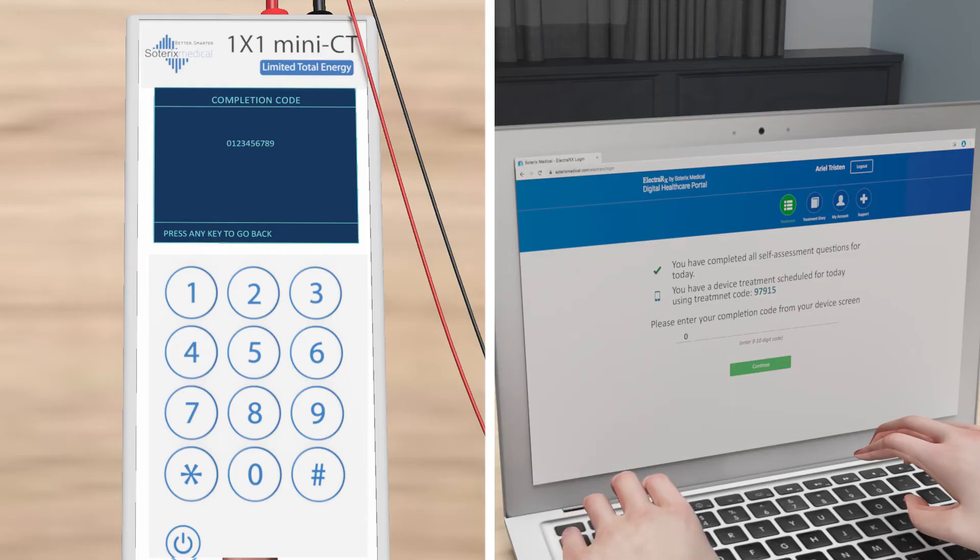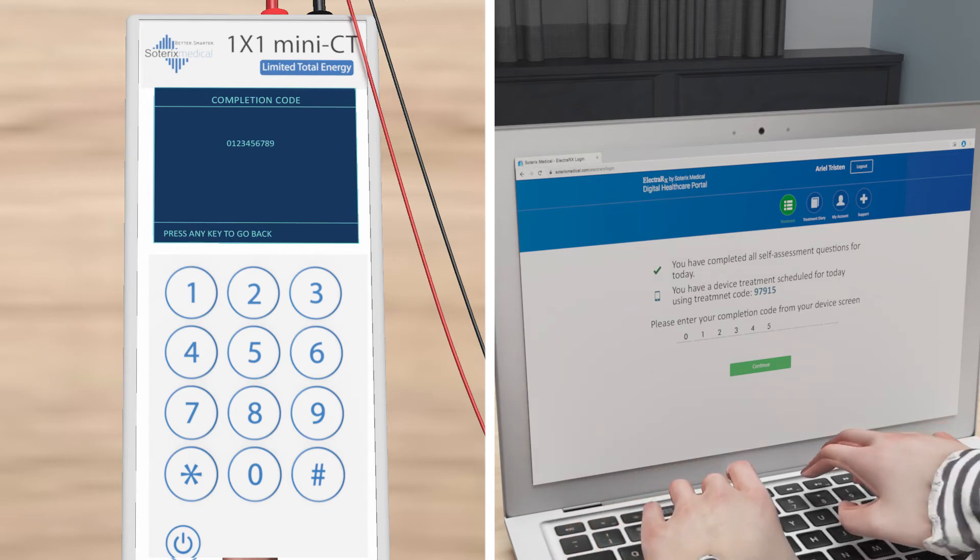After the stimulation is complete, enter the completion code provided by your mini-CT device back into the ElectraRx portal to complete your session for the day.